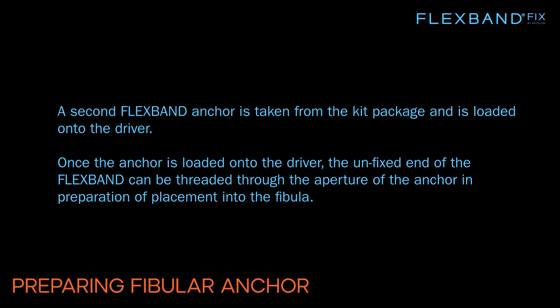A second FlexBand anchor is taken from the kit package and loaded onto the driver. Once the anchor is loaded, the unfixed end of the FlexBand can be threaded through the aperture of the anchor in preparation for placement into the fibula.